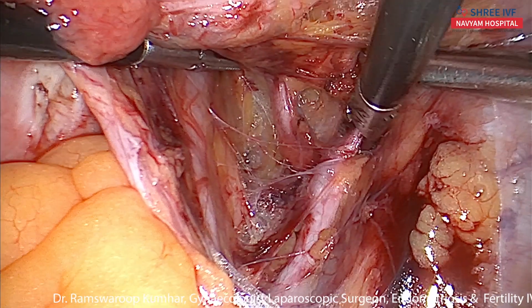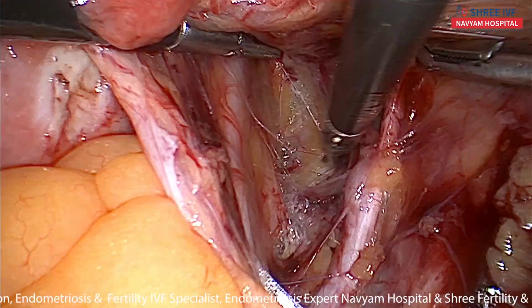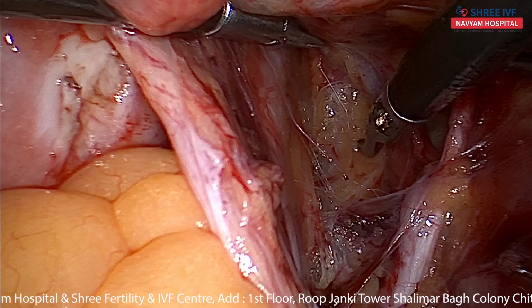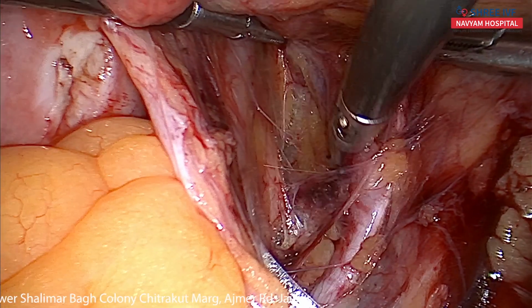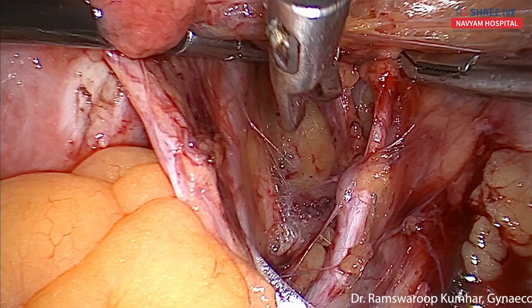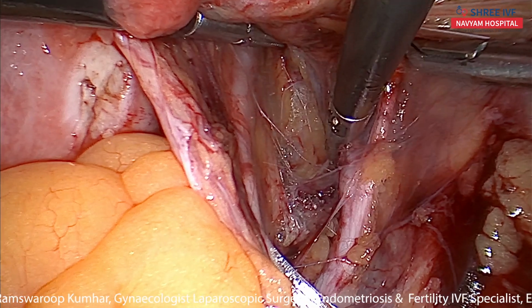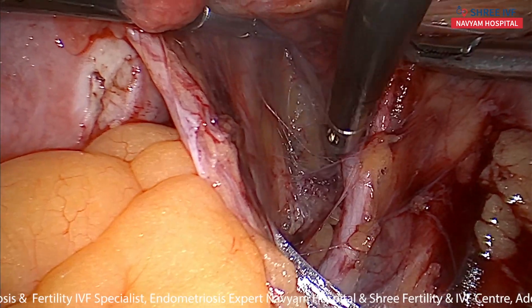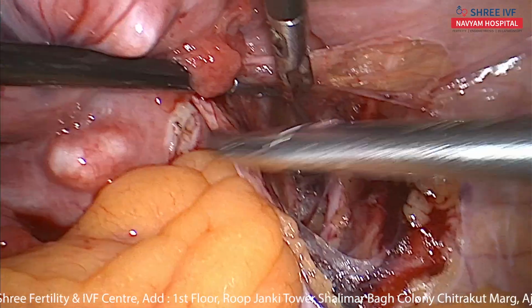This is the continuation of the internal iliac artery going on, and this is the branch which is tortuous and going medially. This is the only branch. The ureter is in my vision, distant from the uterine artery, and then coagulation. No need to cut it. Gentle. Okay.